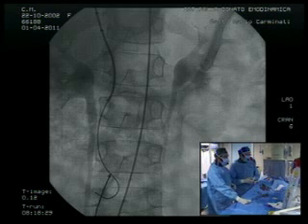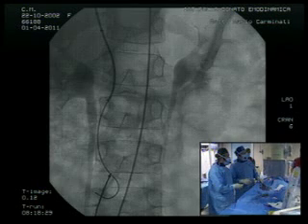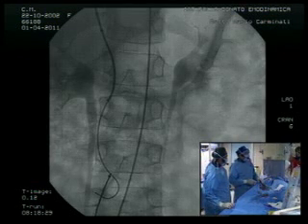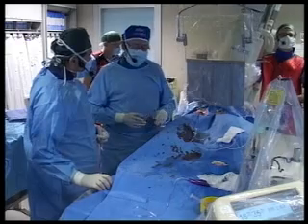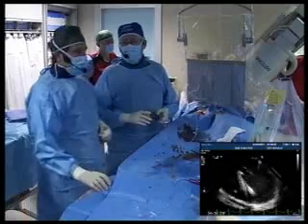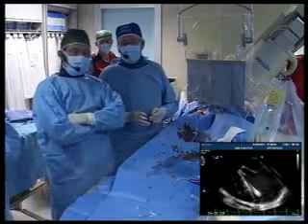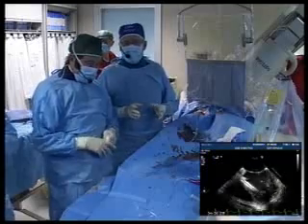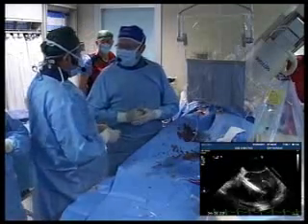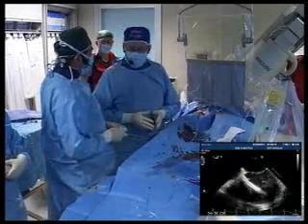Yeah. So let's go back to the angiogram or the real-time fluoro and echo. Kevin, what size? So we put in an 8 French torque view, the membranous device torque view, the 180-degree curved one, to give us a little extra space. Although I guess the devices that we could deliver would probably go through 7. We've not decided yet about the device. You should ask the audience, Kevin.